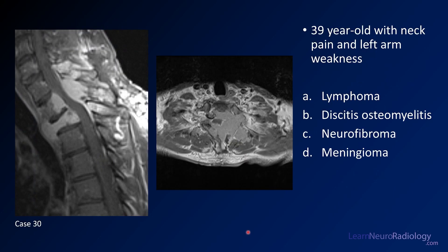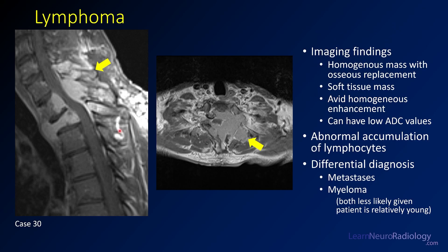Case number 30, our final case: a 39-year-old with neck pain and left arm weakness. Two post-contrast images, sagittal and axial. Choices are lymphoma, discitis osteomyelitis, neurofibroma, or meningioma. The answer is lymphoma. There's homogeneous enhancement involving several vertebral bodies and posterior elements, with extension into the epidural and prevertebral space. There's no significant cystic fluid component, which would be expected with infection. This homogeneous pattern suggests lymphoma or myeloma. Metastatic disease tends to be more rounded and focal. The patient's relatively young age also favors lymphoma; the differential includes metastasis and myeloma.